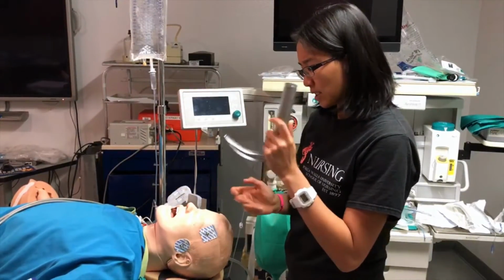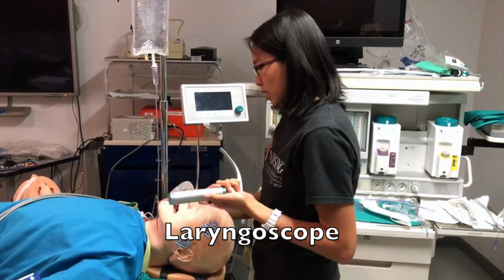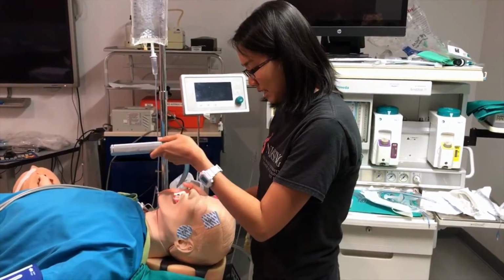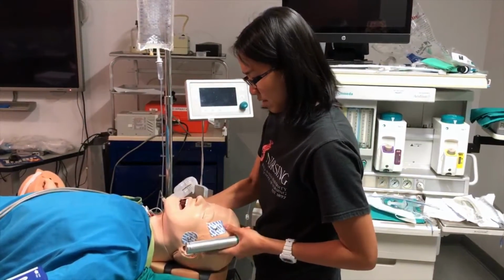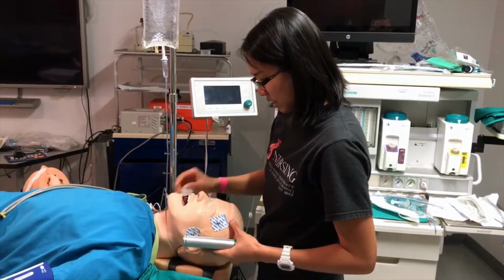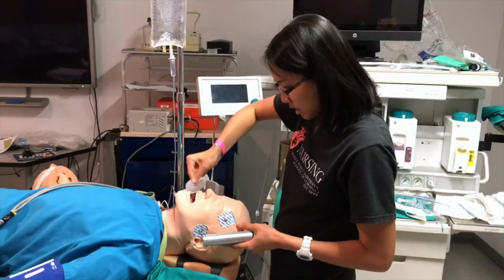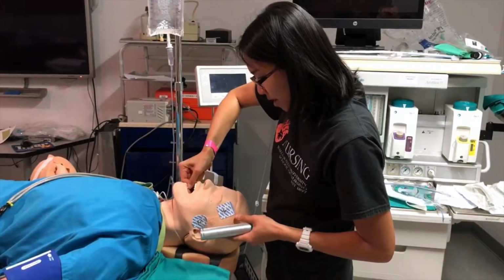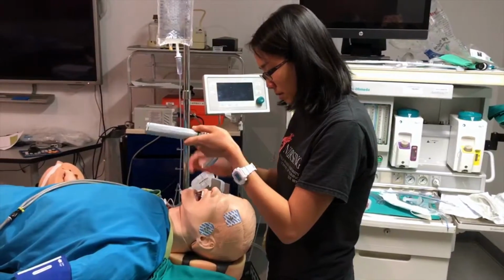So you want to have this laryngoscope in your left hand when you get ready to intubate. Make sure the neck's in the right position. You can do gentle extension of the neck, or just do a scissoring technique, and you extend it more in the mouth. It just opens up the mouth more, so you can fit the blade in.